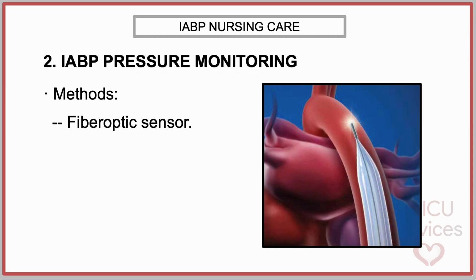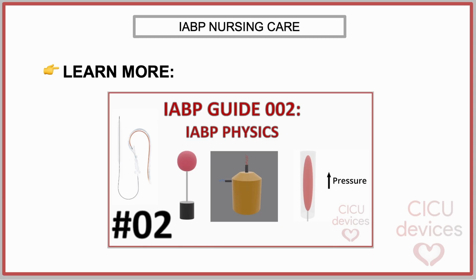Unlike fluid-filled systems, fiber optic sensors do not require continuous flush solutions or pressurized bags, reducing maintenance tasks and potential sources of error. Learn more about fiber optic pressure sensors in our video, IABP Physics.